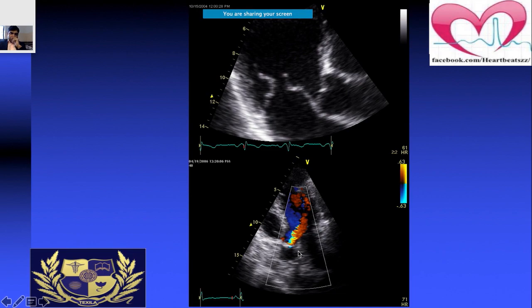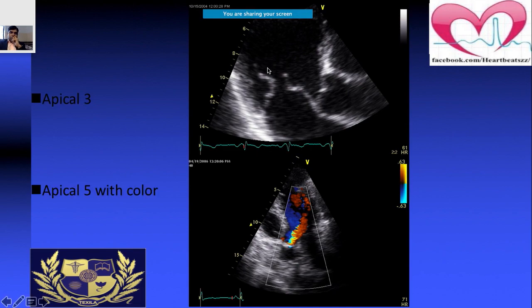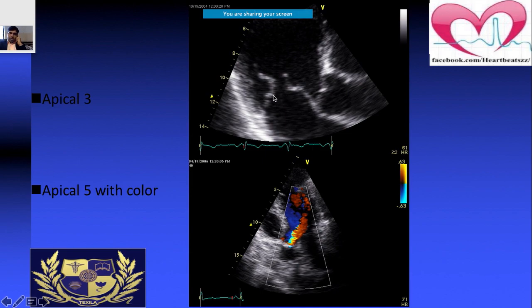After the two-chamber view, when you tilt the probe slightly, you start seeing the apical three-chamber view. The third chamber here refers to the aortic valve view. Tilting further gives you the apical five-chamber view — left atrium, LV, RA, RV plus the fifth chamber — shown here with color Doppler.